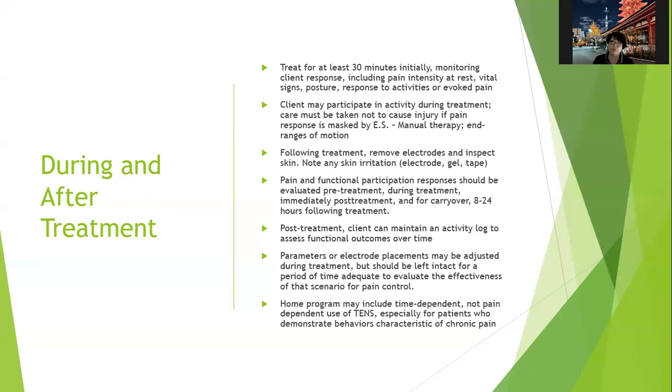So say you're going to use it for a certain amount of time each day, especially for patients who have chronic pain. It's better to do time-dependent rather than pain-dependent, because a lot of people with chronic pain just have pain all the time. And so you want to design a home program for them that is going to take that into account.